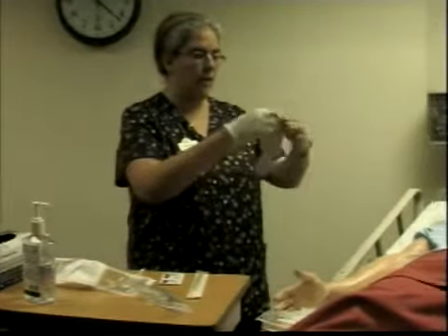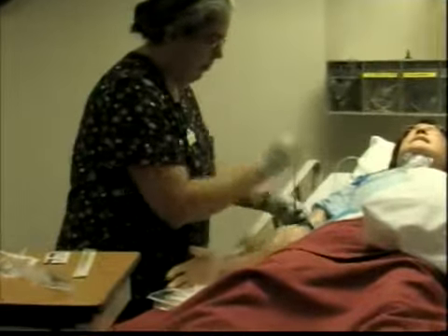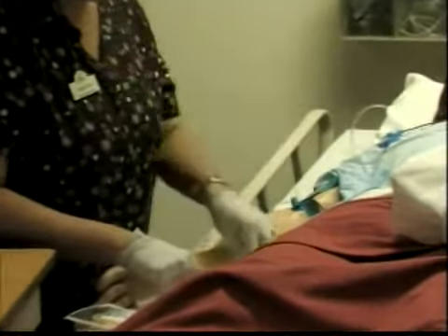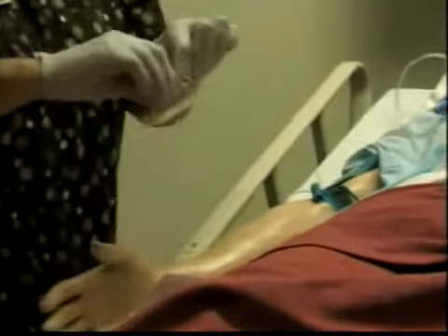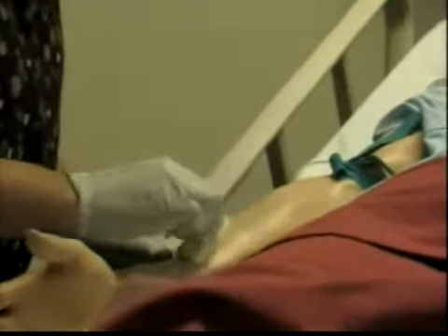And these are clean gloves. I am going to put my tourniquet on, and you have about a minute to make sure that the tourniquet only remains there for a minute. You will break the seal. You clean in a circular motion from the inside out, and you discard.